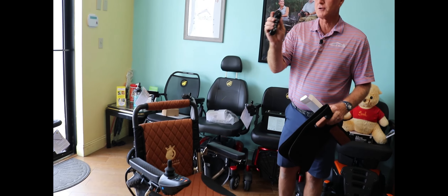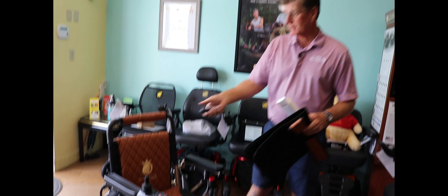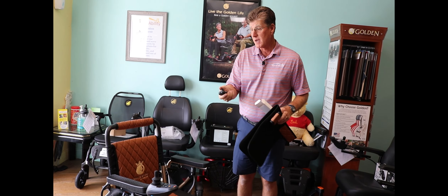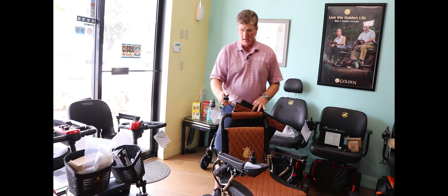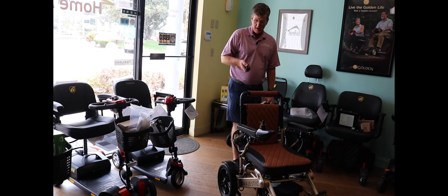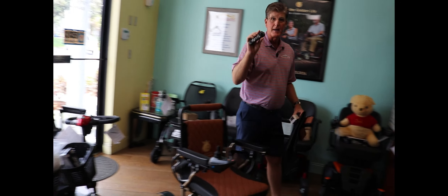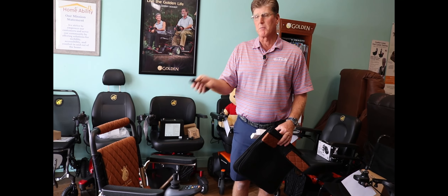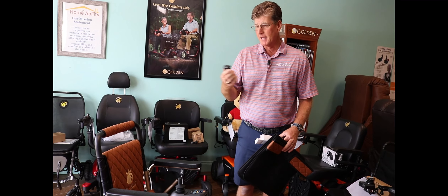With the attendant remote, I can control the chair from across the room. I can power the chair up and make it move. What makes this great is that if I'm the caregiver helping someone move, I can stand behind it and control it, or control it from across the room. If I'm mobility impaired and the chair is across the room, I can bring the chair to me using my controller and then get on it.